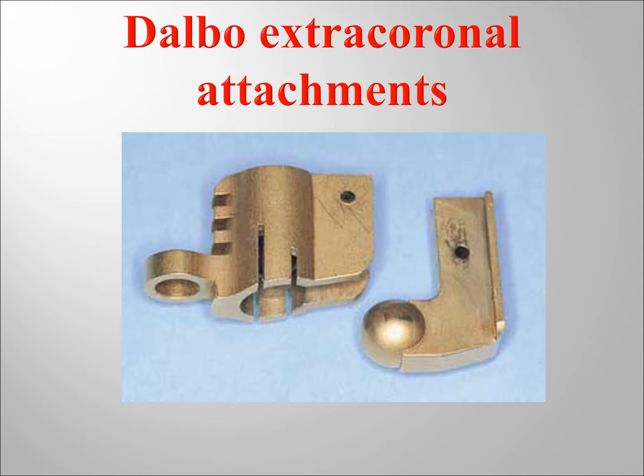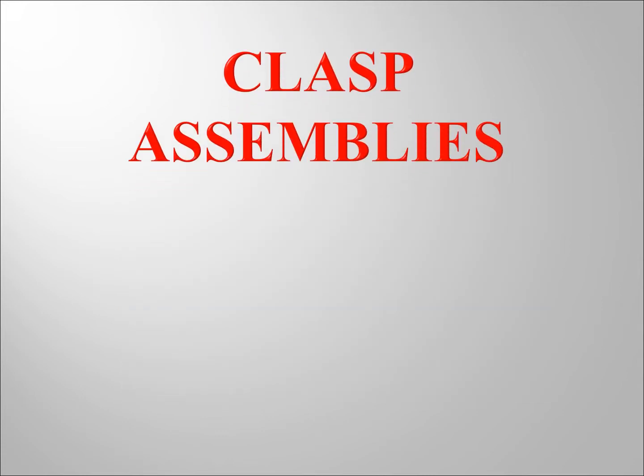You will take them in the fifth year. Now you fix the extracoronal attachment on the tooth outside the contours, and this is the male part, and the female part is within the prosthesis, and they clip precisely on each other, and that's how they provide retention.